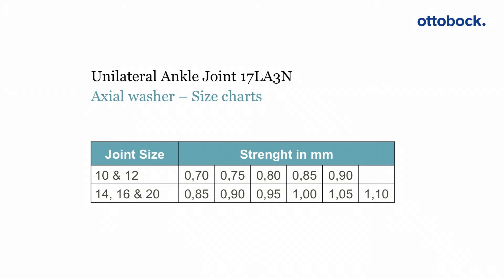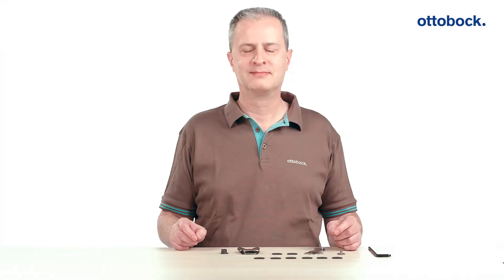Five different thicknesses are available for joint sizes 10 and 12. For sizes 14, 16, and 20, six different thicknesses can be selected. The size and thickness is indicated on the axial washers.